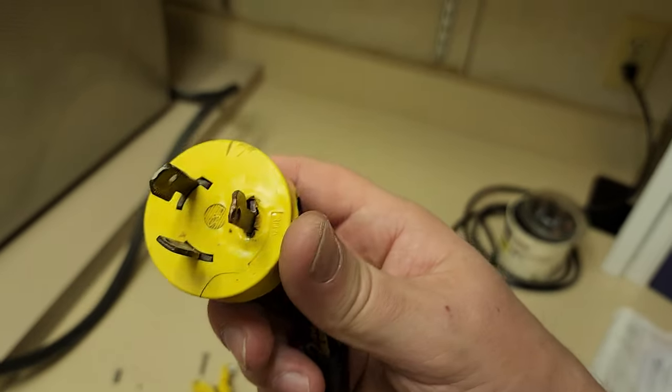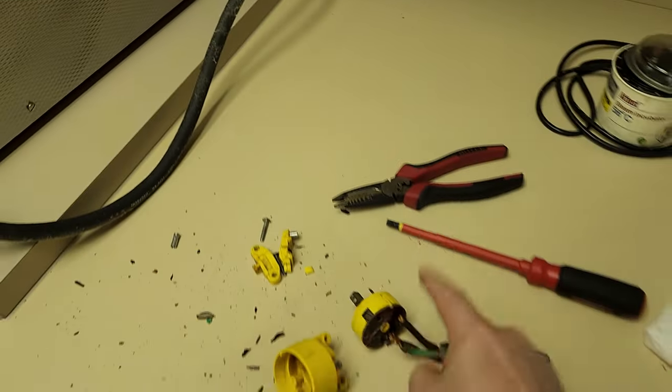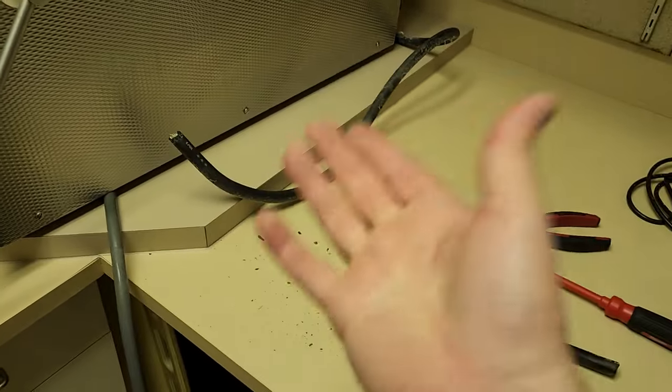And this one here is a 30 amp, 250 volt twist lock. So that's my project. I gotta find one of those. Gotta ohm this guy out, make sure that there's no dead shorts, because otherwise it'll just happen again. And then the electrician, because the plug got hot, has got to go in and check out. My breaker is live right now, but I have no power coming out of the wall. So I got some work out for me.